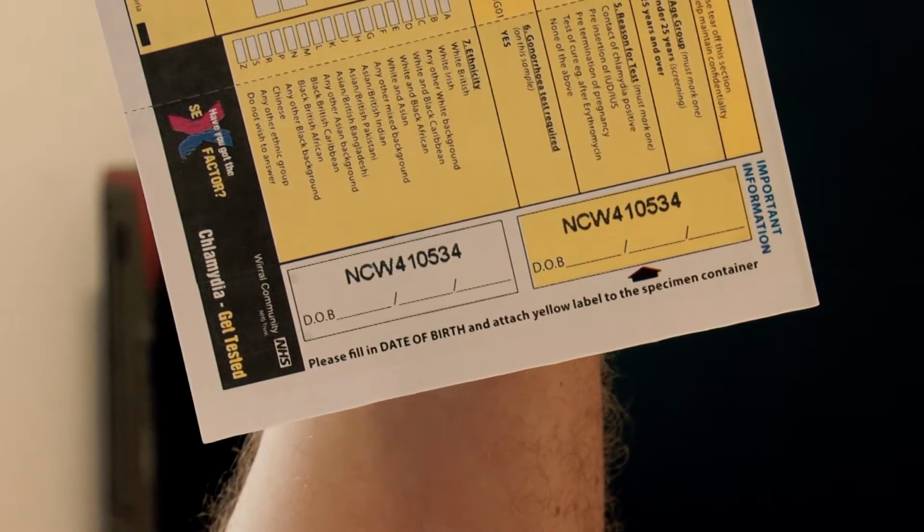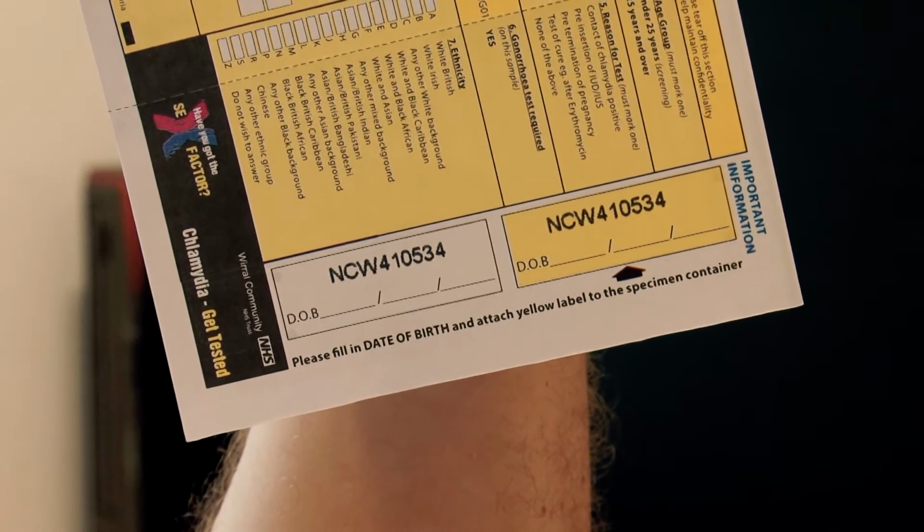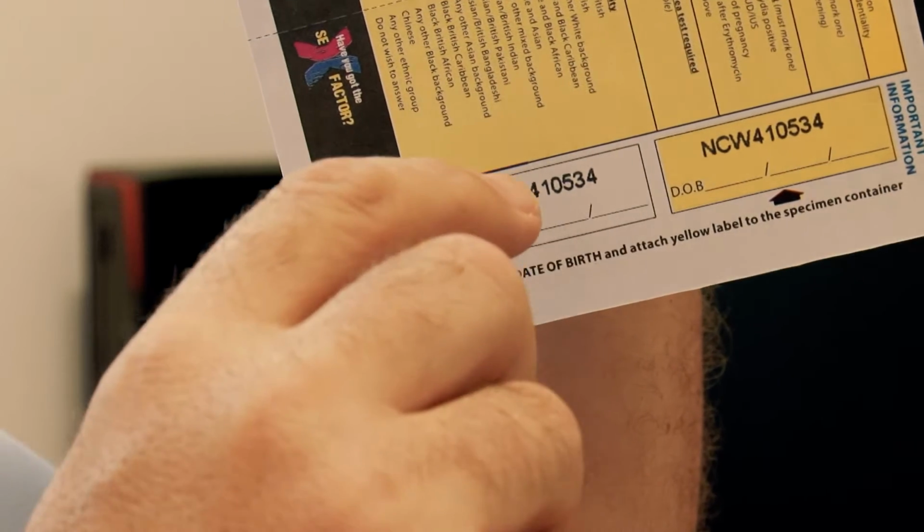Now you'll see in the yellow form there's only 2 stickers. So if you have 3 tests, for example, you have the throat, the rectal, and the chlamydia, the urine or the swab, sticker your vaginal swab or your urine test, and then also sticker either the throat or the rectal, but write on whether it's throat or rectal, and then on the other bottle, write your NCW number, which is on here, and then your date of birth. If you get a blue form, you'll have 4 stickers on it, so you'll have enough to do each sample.